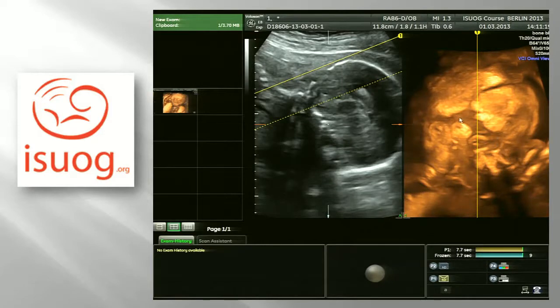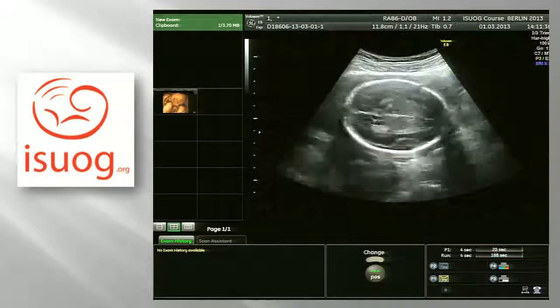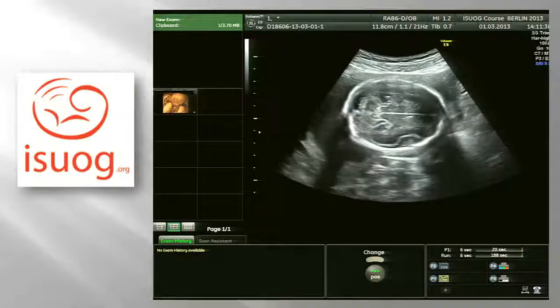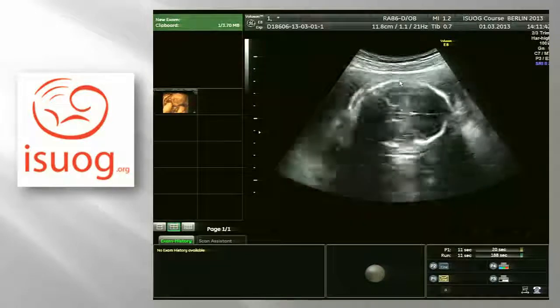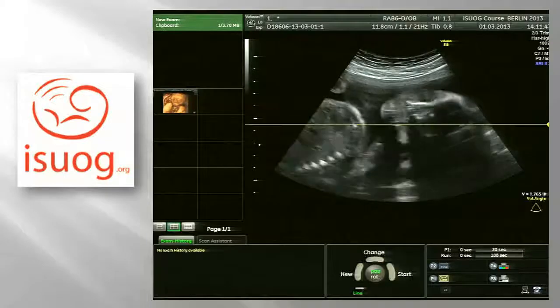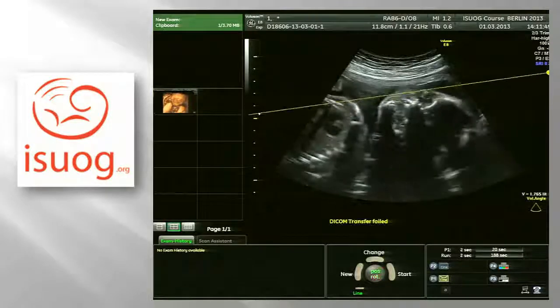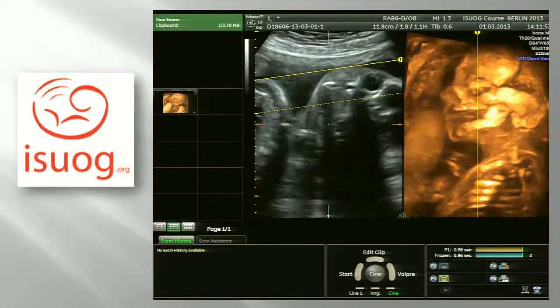And this is a large suture, and it's why it's possible to see the brain, because when you do the scan axial view, this is a window where you can go and see the brain. When you have a nice view of the brain here, it's only because you are inside this suture. I move back. The skull.